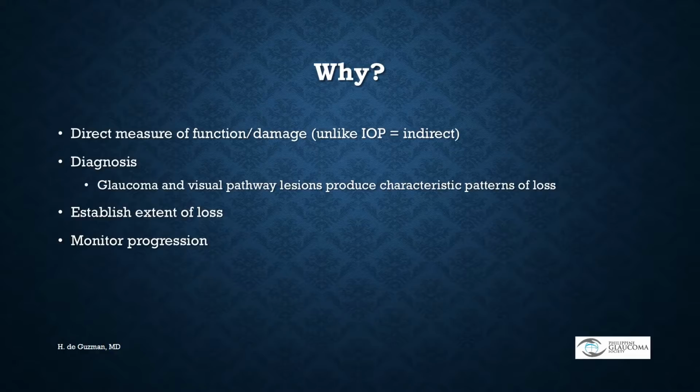Also, perimetry can help us determine where the lesion is or what the disease type is because of the characteristic patterns of loss that we can sometimes see. We can also establish the extent or the degree of the defect and monitor progression.